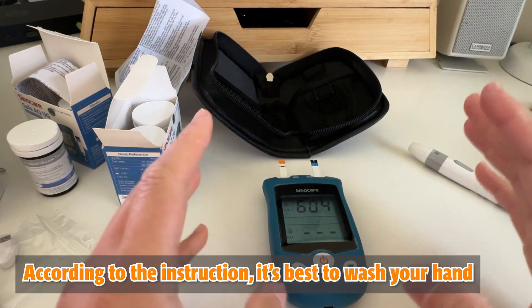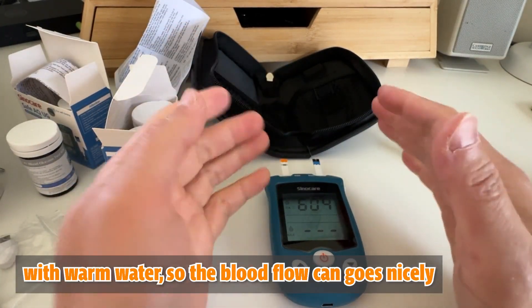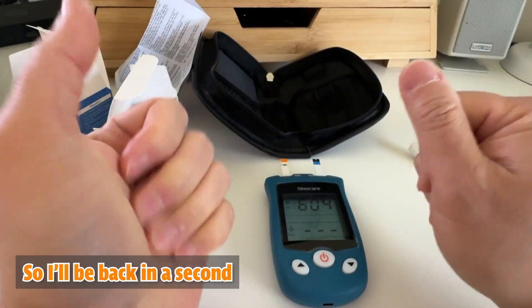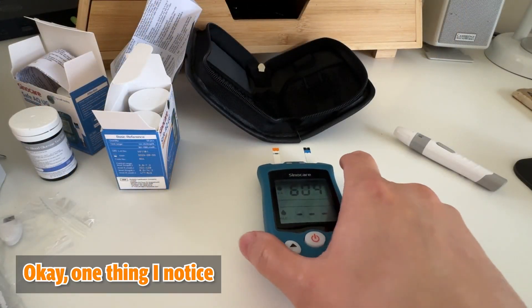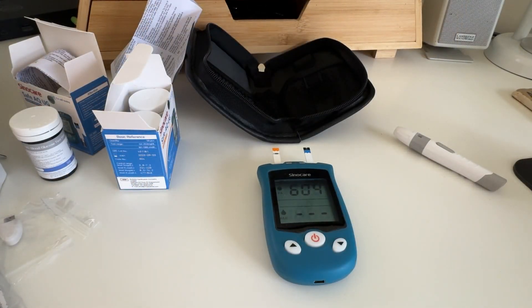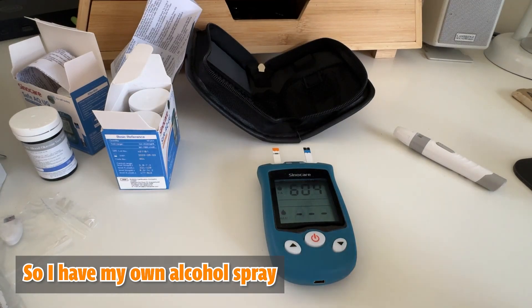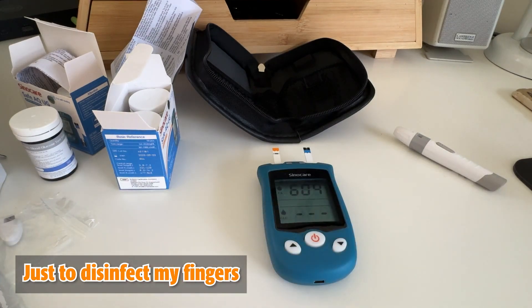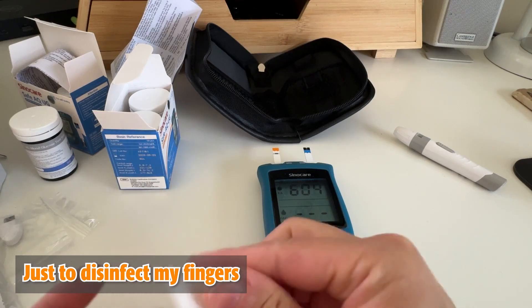According to the instructions, it's best to wash your hands with warm water so the blood flow can go nicely. One thing I noticed: the package does not come with alcohol wipes, so I have my own alcohol spray just to disinfect my fingers.